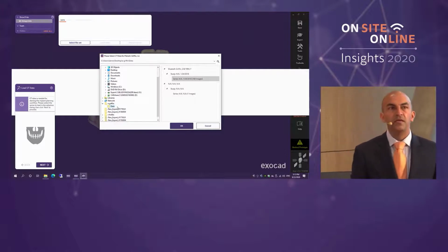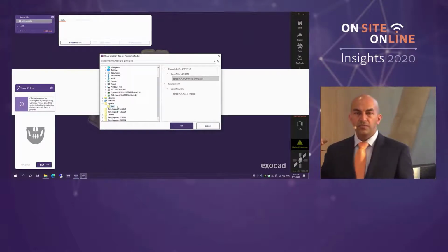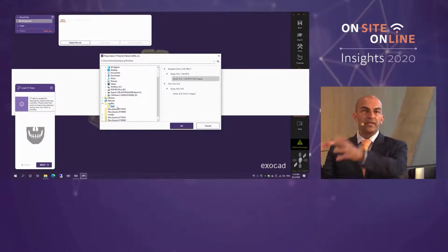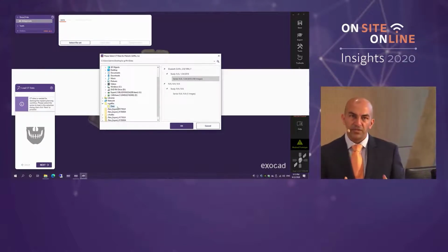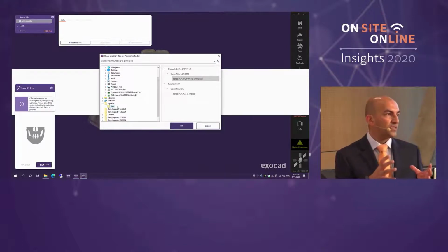The second thing is the amount of data that you collect. So you will see in a moment what we will be doing is we'll be correlating CBCT data with intraoral scan data. Now in the UK, it's very, very strict about how much the radiation dose is to patients. So what's happening there is that they're doing tiny little sectional CBCT scans.